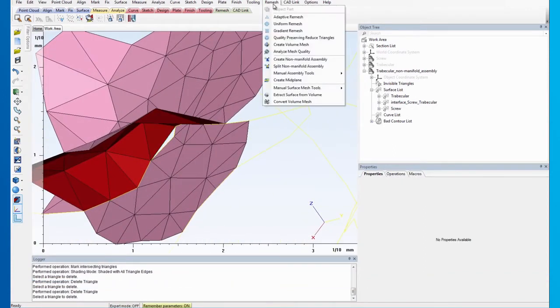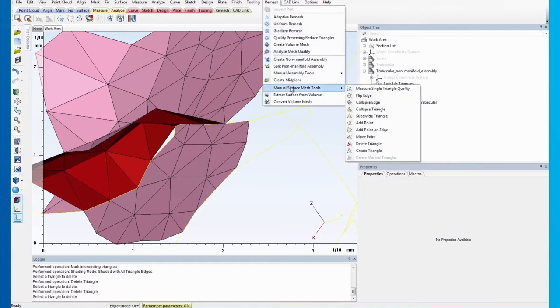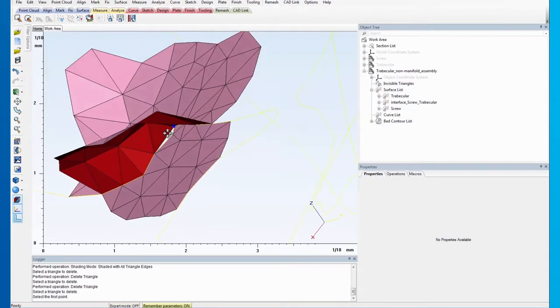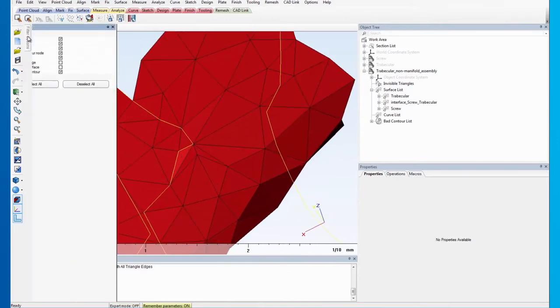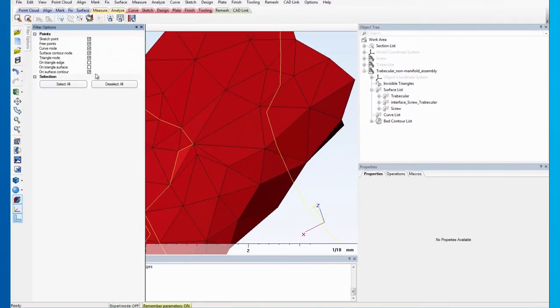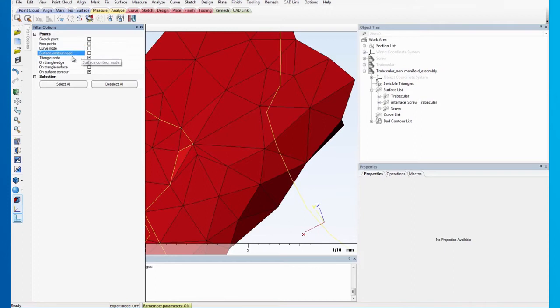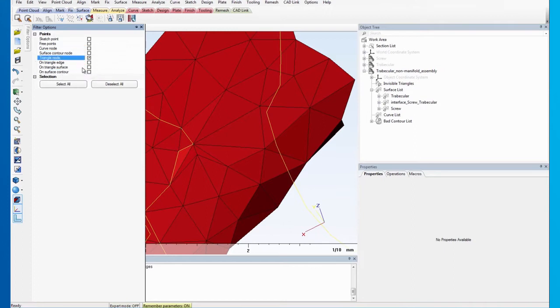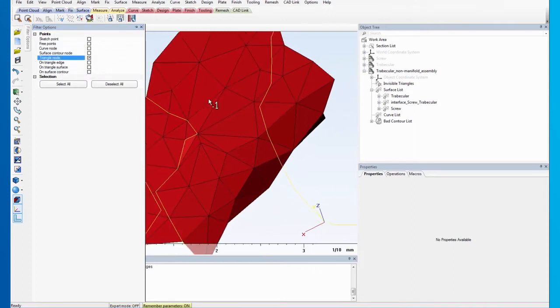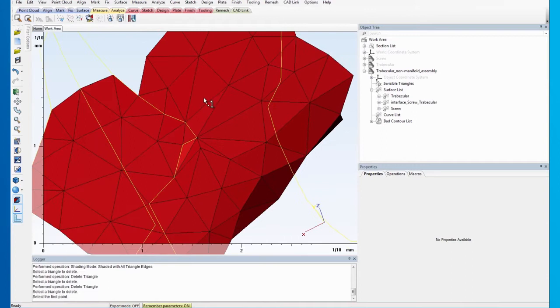Then, use Create Triangle to patch the hole. To ensure that the patching fills the hole perfectly, press F3 to open the filter options. Make sure the Triangle node option is the only checked filter.